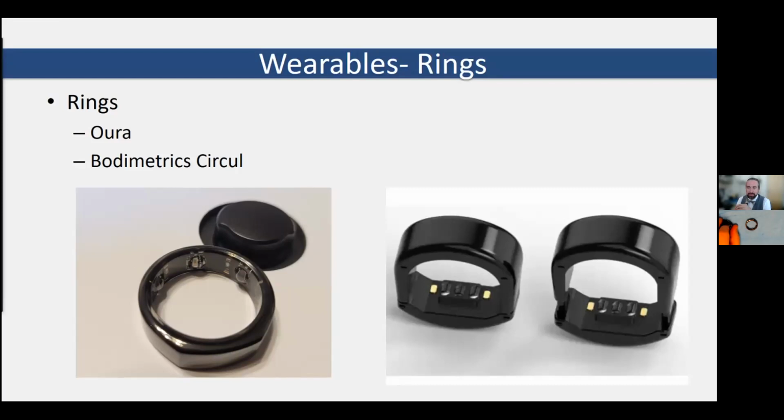We did note for a lot of the devices that we work with, the smaller form factors, these more passive devices, had much better battery life. We were getting maybe 2 days, maybe a day and a half out of the smartwatches, and we're able to get maybe 3 to 5 days out of most of the smaller devices. They connect via Bluetooth to your app. You will get some notifications through your smartphone, maybe reminding you to move, but it's a lot more passive than what we see from the smartwatches. All right, back to you, Garrett.